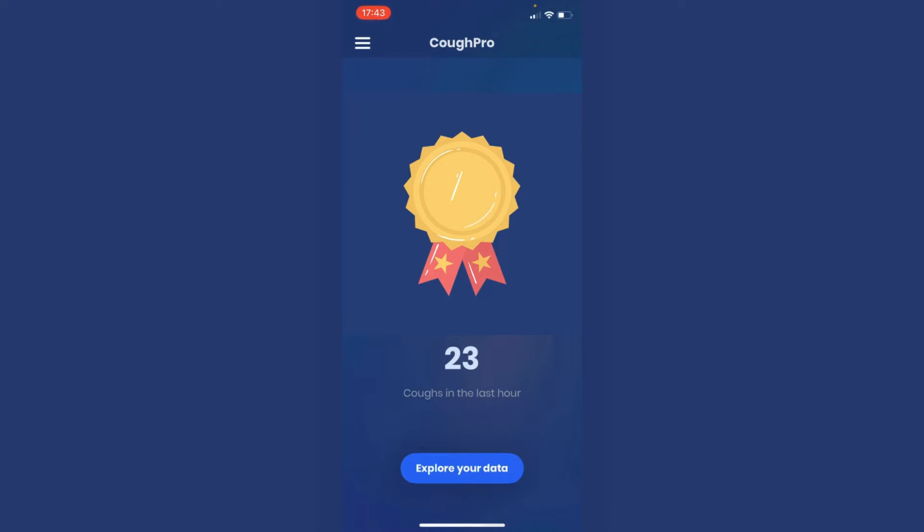Congratulations! You have now learned some valuable tips and tricks for optimizing your cough tracking experience with CoughPro.